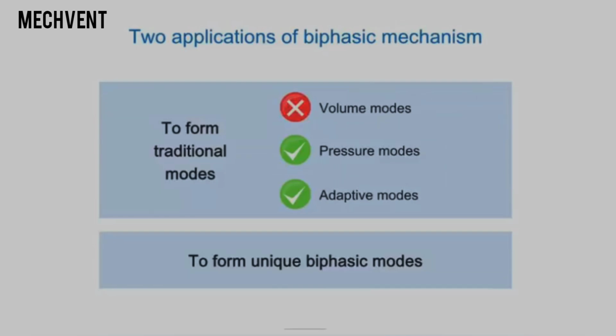Biphasic mechanism is mainly applied in mimicking traditional pressure and adaptive modes and forming unique biphasic modes. Duo PAP and APRV are 2 typical biphasic modes. The 2 modes may be merged into one.